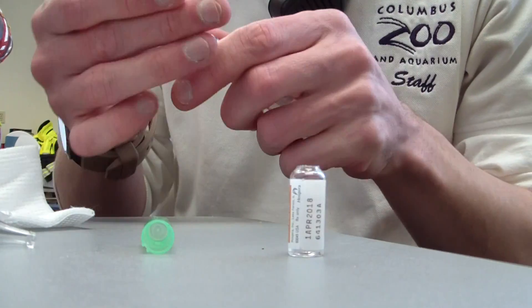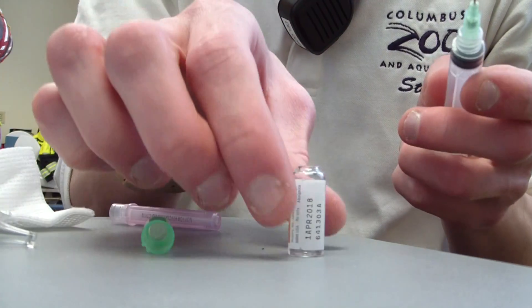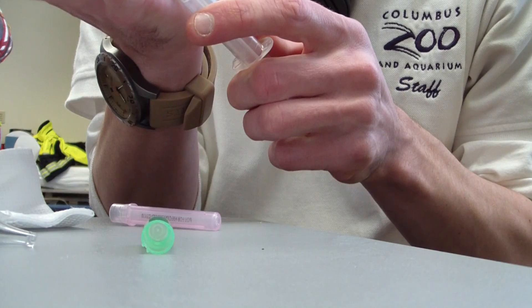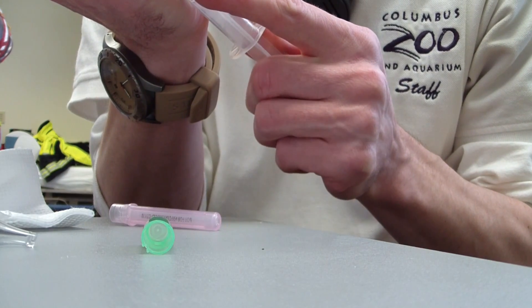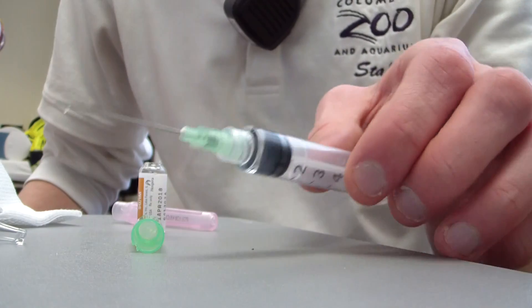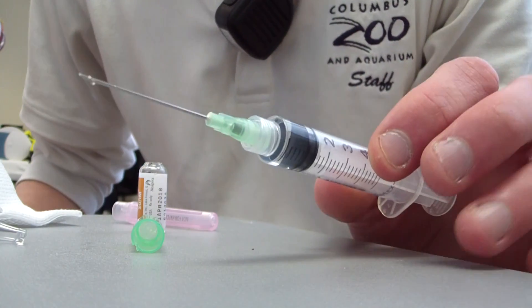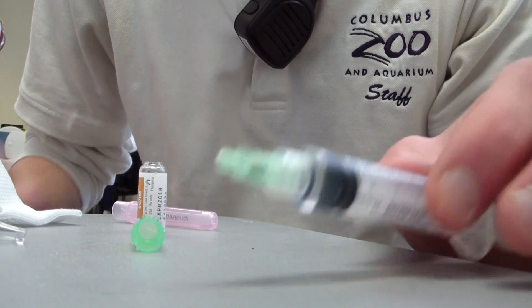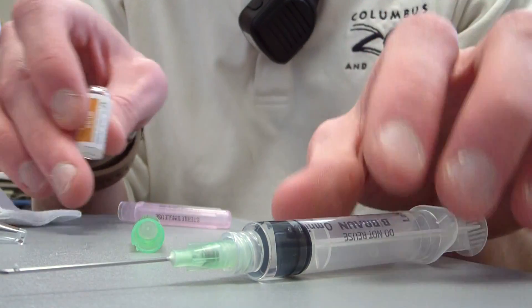Pull the needle out and draw as much as you need. After you have administered your medication, this all goes into the sharps — everything goes into the sharps.